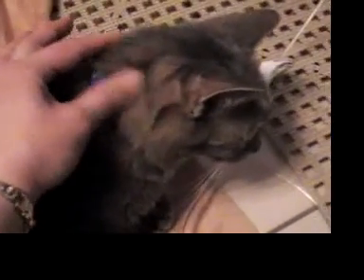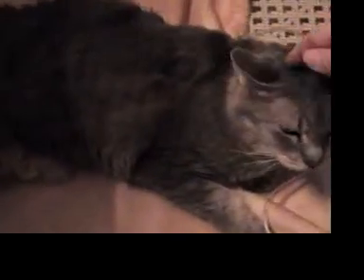Again, some cats might need to be restrained more. I might need to hold them between my knees. For most of my cats, I found they very quickly catch on to how this works. And at most, I just need a hand on their back, reminding them they're not done, they need to wait.